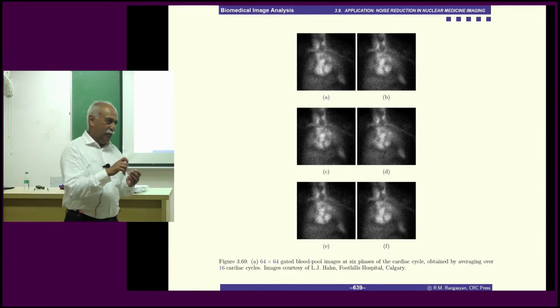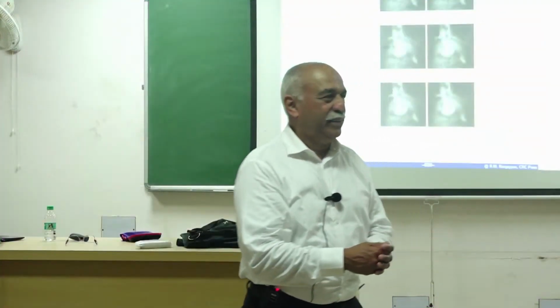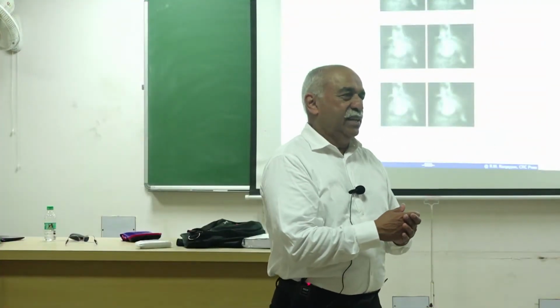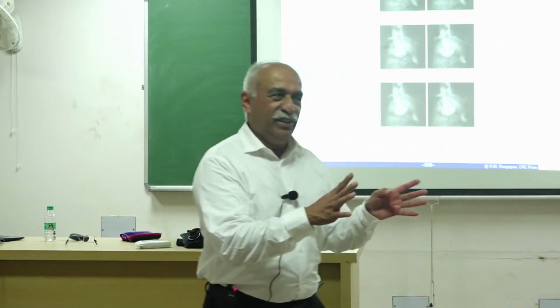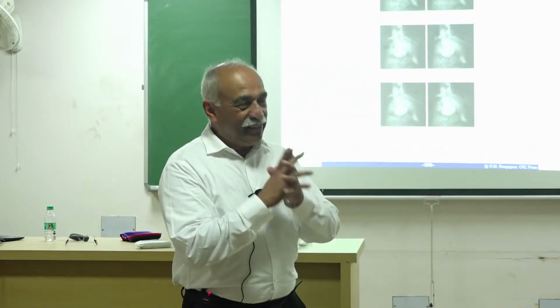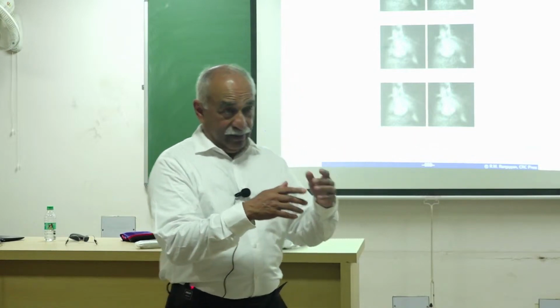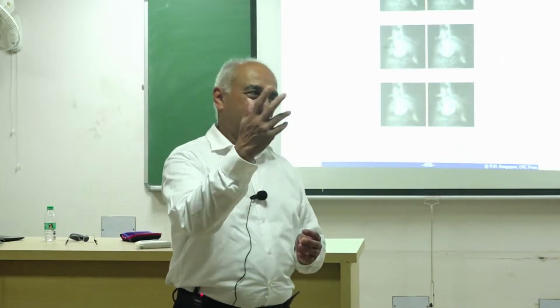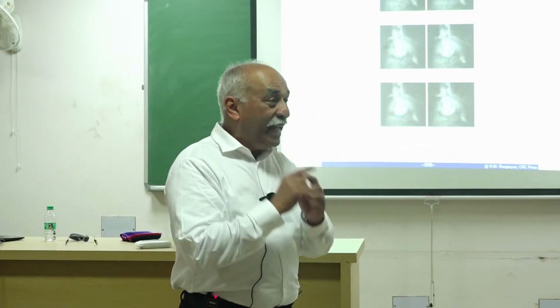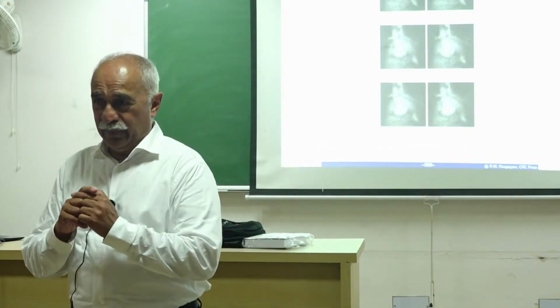We concentrated on mammograms because I got research grants for that, and I had a collaborator, and we collaborated with the breast cancer screening program in Alberta, and nobody was interested in noise removal. They were interested in contrast enhancement. And we, with many radiologists, did detailed analysis and we gave our program to others and they did analysis of enhancement, contrast enhancement. Contrast is always the issue.